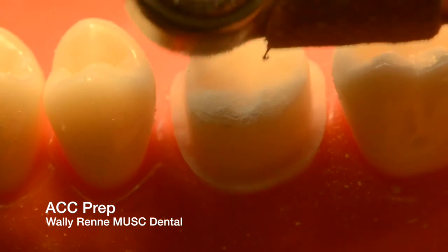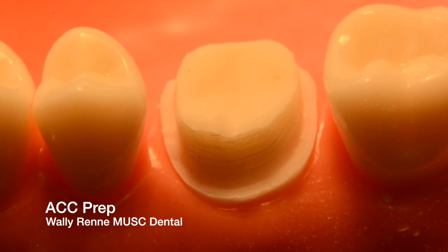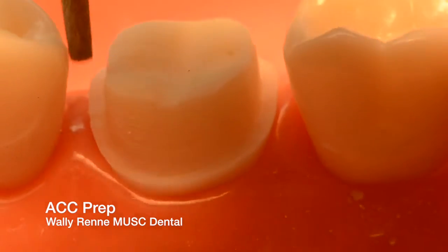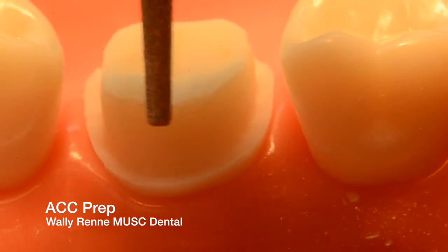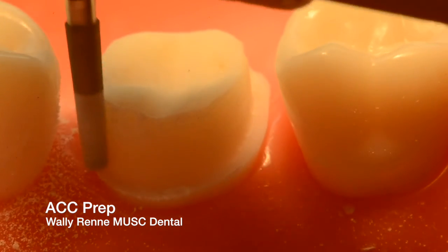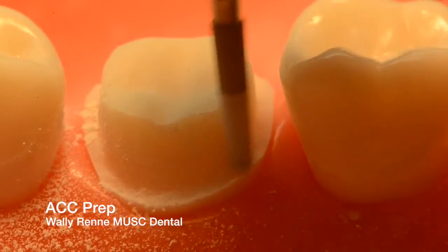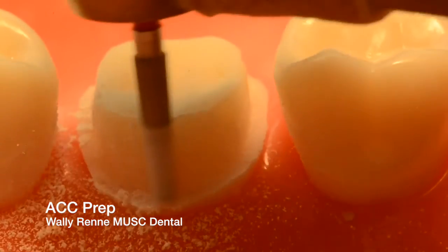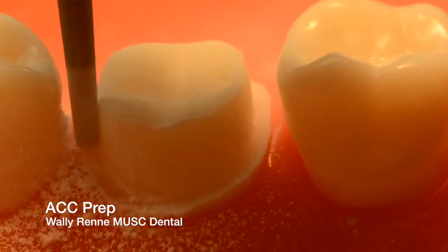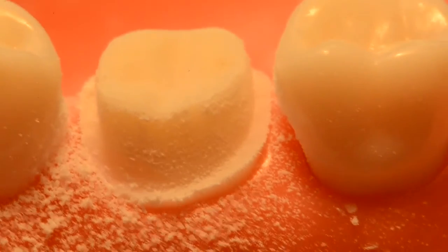This polishing step is one you do not want to cut corners on. I'll often spend 5 to 10 minutes on it — roughly 5 minutes for the rough cut prep clinically and another 5-10 minutes polishing and doing a self-assessment of the preparation, making sure you have perfect symmetry on your finish line. Facially, I like to keep the finish line about 1 millimeter supragingival. Later in the semester we'll talk about more conservative preparation types that don't require much axial reduction and keep the margin about 0.7 millimeters supragingival, but we won't go over that right now. And that's the non-functional cusp bevel there — just a slight rounding.